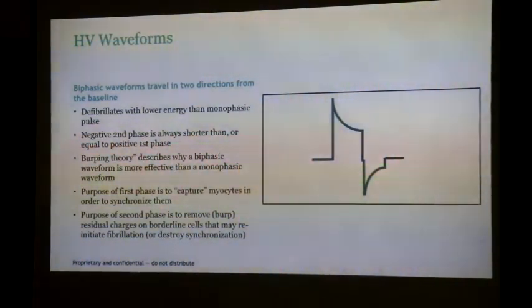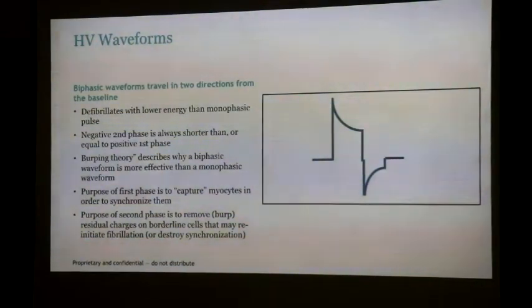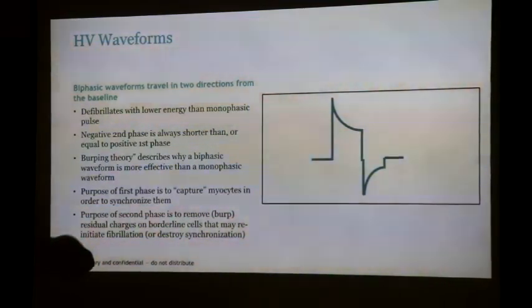So there's a study going on at the moment, recruiting somewhere in the US, looking at putting single coil leads in a septal position. Here the vector is going to be from the coil to the CAN. So if you've got an RV coil at the apex, it's quite anterior, and a CAN up here, that's anterior. The left ventricle is posterior.